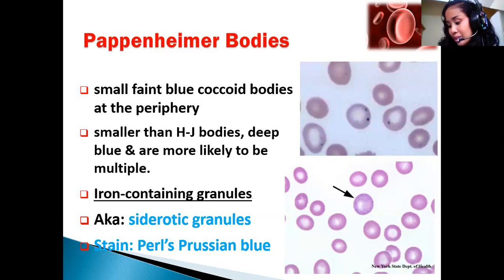And guys, once we reach Hema 2, and actually it's in your notes, you have ringed sideroblasts. Sayang hindi ako naglagay ng photo ng ringed sideroblasts, but that's your quick Google assignment. So, anong itsura ng ringed sideroblasts? Your ringed sideroblasts are blast cells which have iron concentrated around the nucleus of the blast cell. So, may iron siya, so we can stain it with Prussian blue. So, pag sinabi kong positive for Prussian blue, then it is a Pappenheimer body.